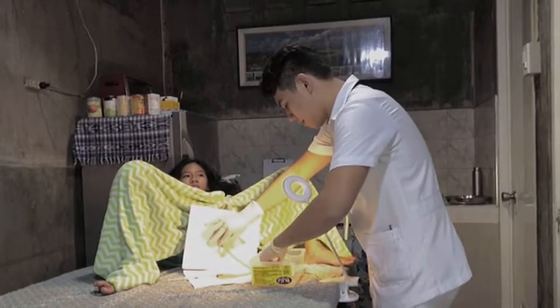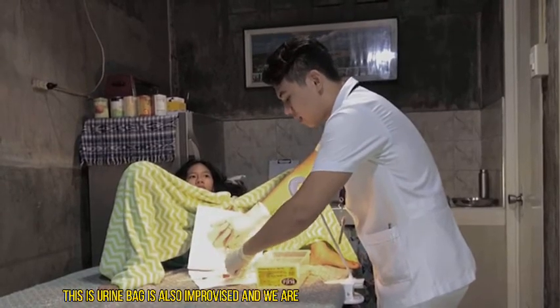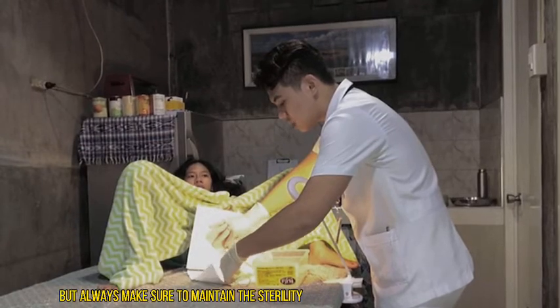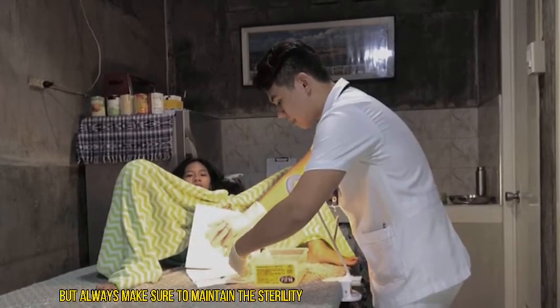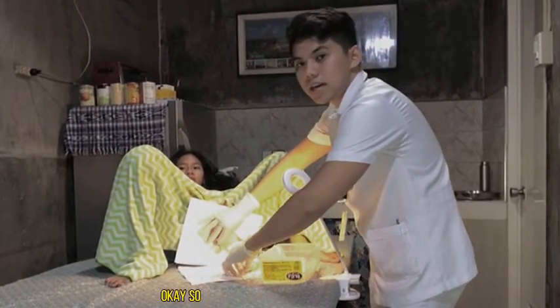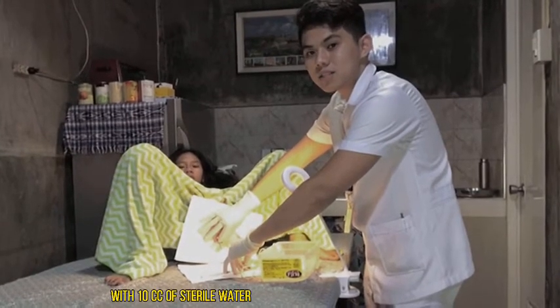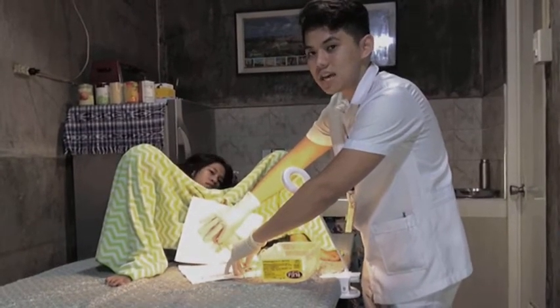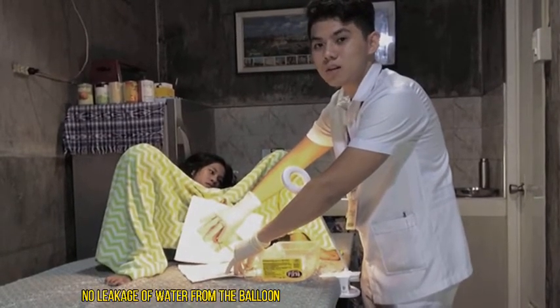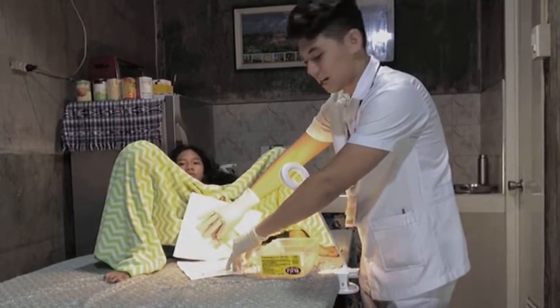So, this urine bag is also improvised and we are inserting it to the catheter, but always make sure to maintain the sterility. Okay, so now we will be inflating the balloon with 10 cc of sterile water using a 10 cc syringe. This will make sure that there will be no leakage of water from the balloon. Thus, it serves the purpose of anchoring into the bladder.